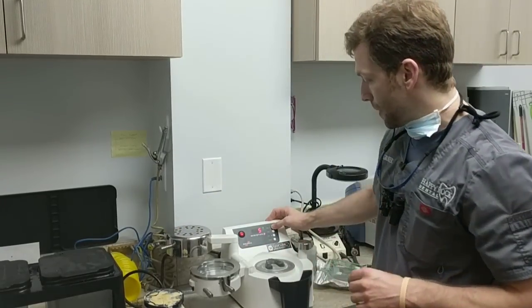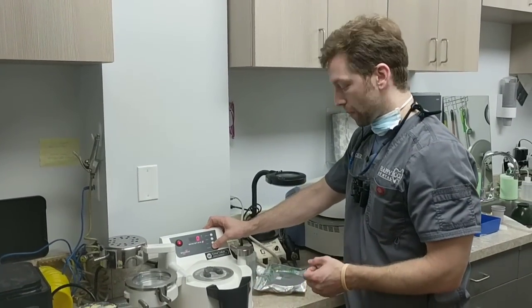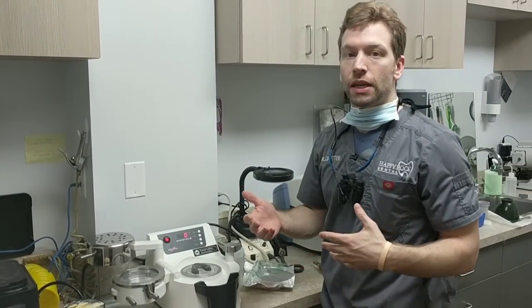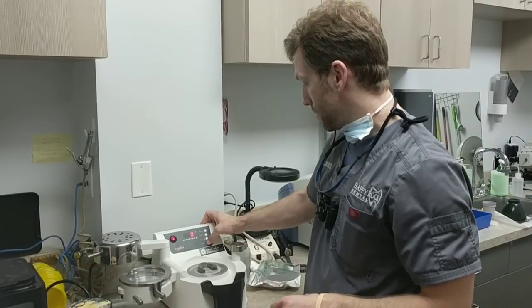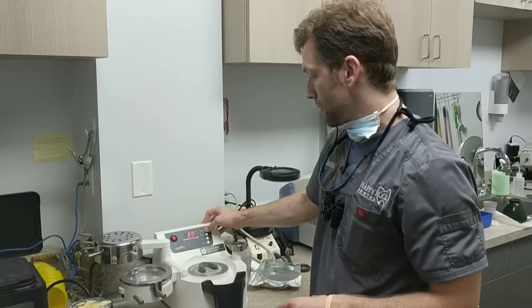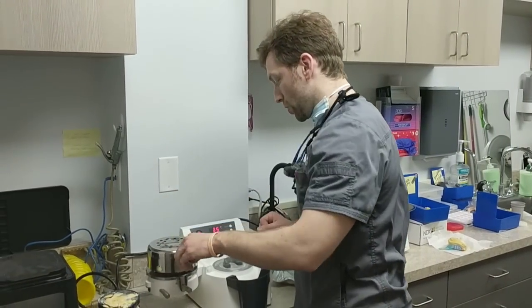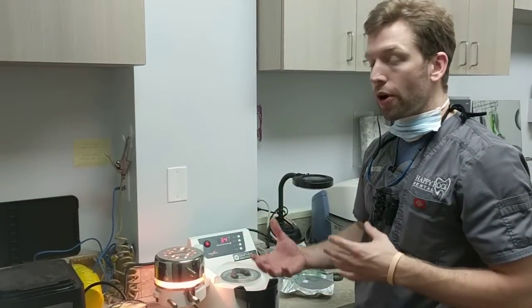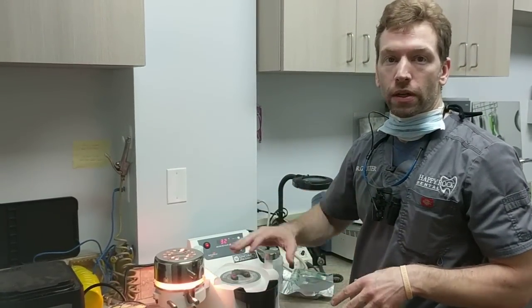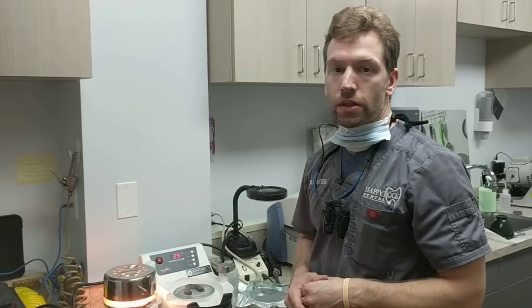Now we're going to go ahead and dial it up. There's a little barcode scanner down here that will allow you to scan the specific material — there are lots of different settings, but we kind of just have a routine down. I'm going to dial it up to 35 seconds and then swing this over here. Now it's going to be heating up. With a suck down you have to monitor and see where it droops and worry about overstretching. With this, just let the machine do its thing.